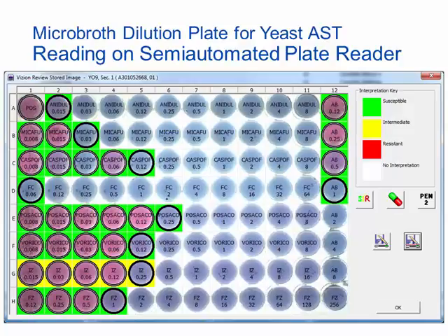In addition, if we compare the micafungin MIC and the anidulafungin MIC, they are within plus or minus 1 doubling dilution of each other at 0.015 micrograms per milliliter and 0.03 micrograms per milliliter. So both drugs should be considered as having essentially equivalent activity in vitro. Having a 1 doubling dilution lower MIC does not mean that anidulafungin would be a better choice than micafungin in this example. Finally, an important point to remember is that yeast must be fully identified to the species level in order to select the correct breakpoints and interpretive criteria. We will explore this in more depth in the upcoming slides.